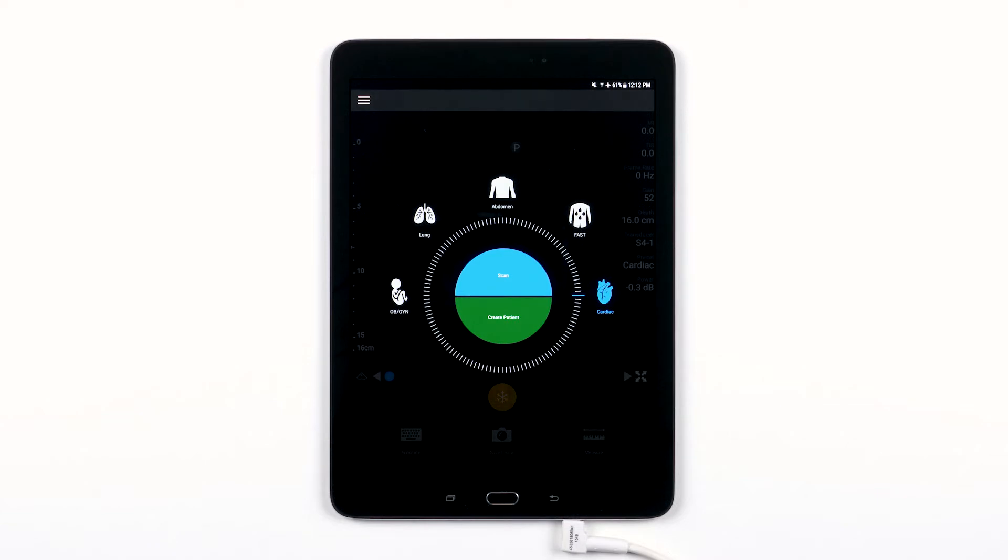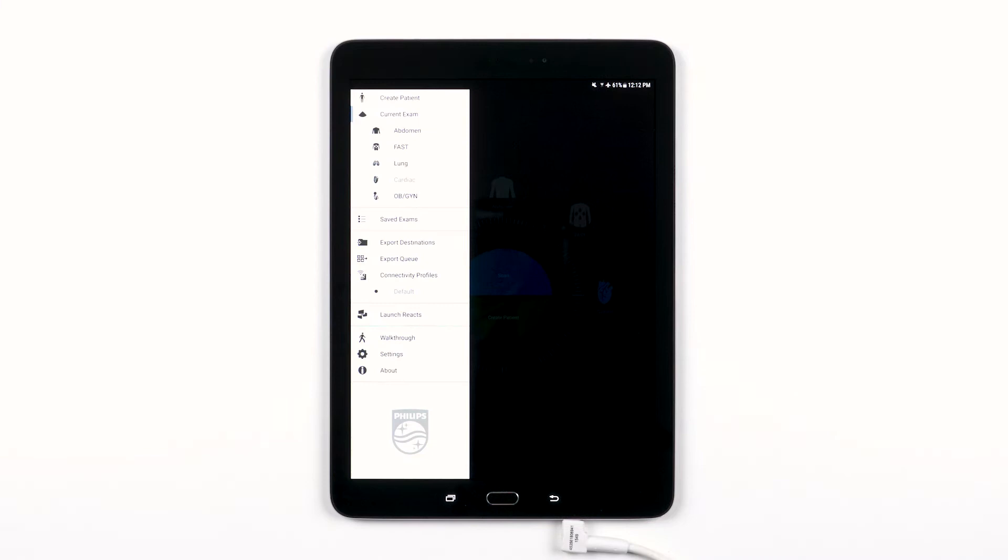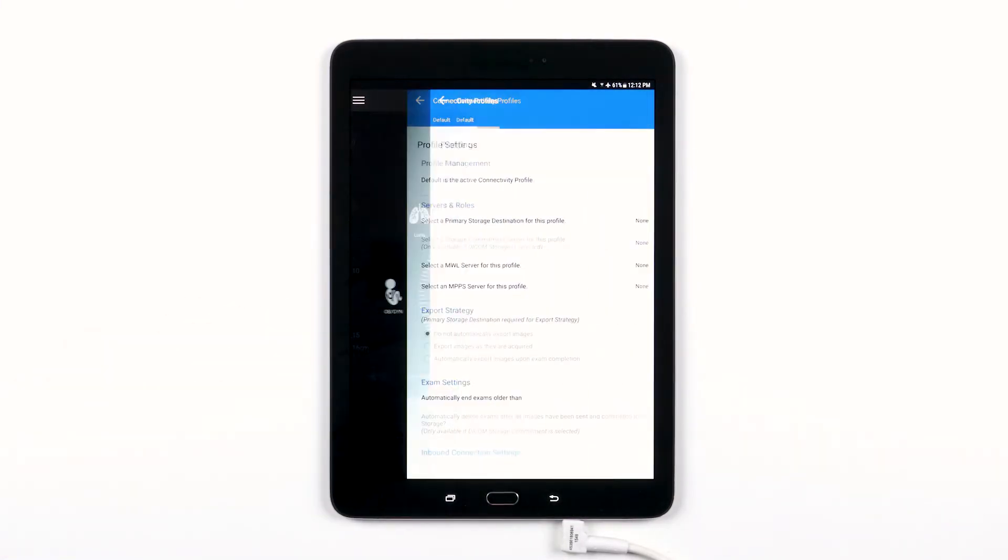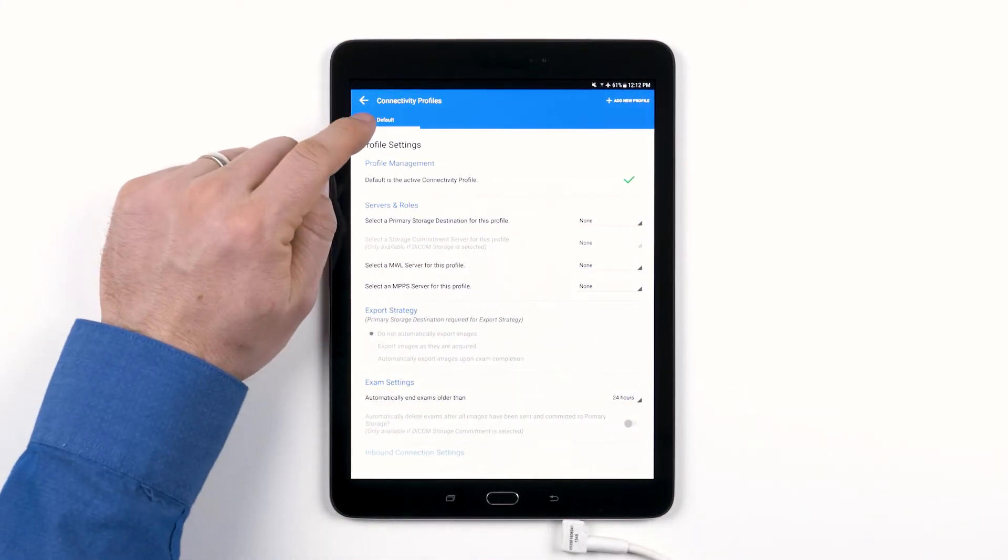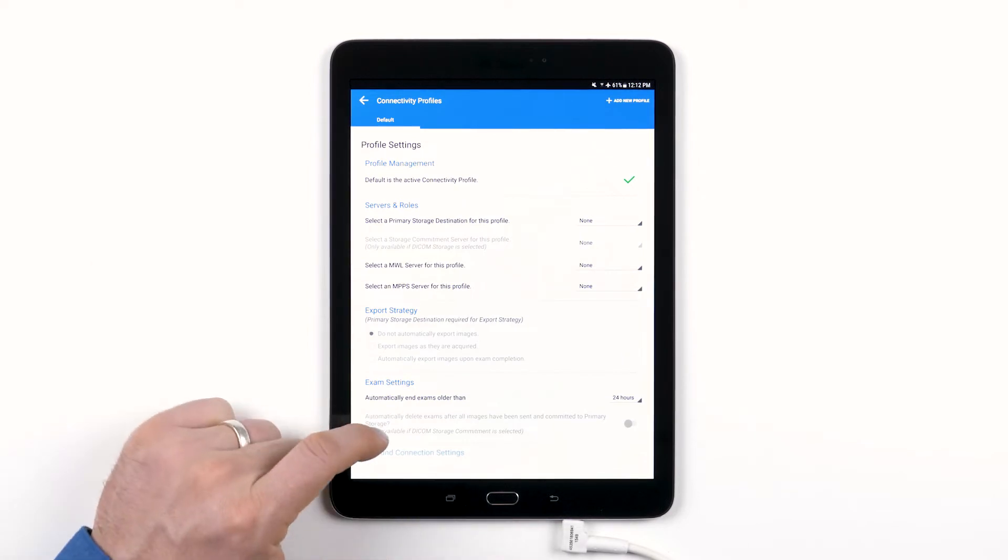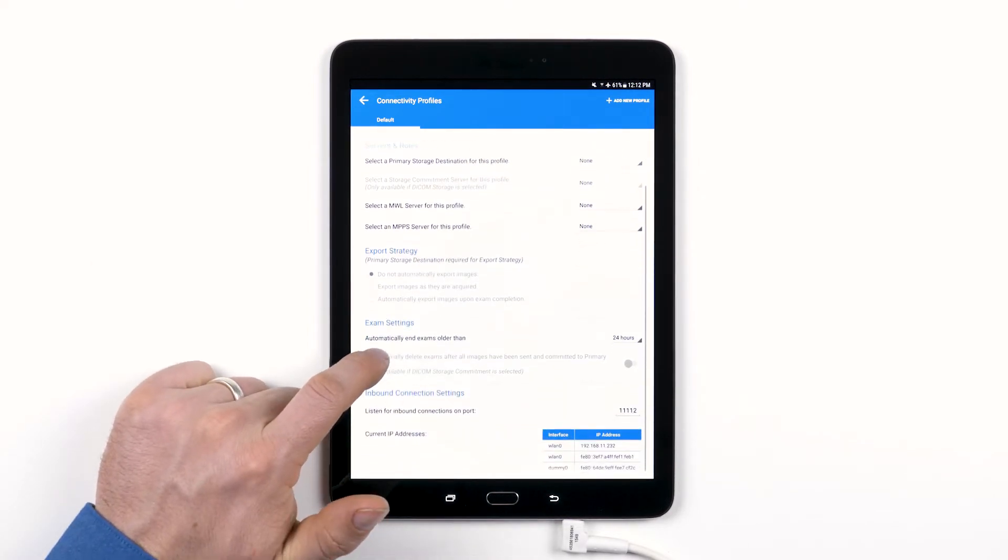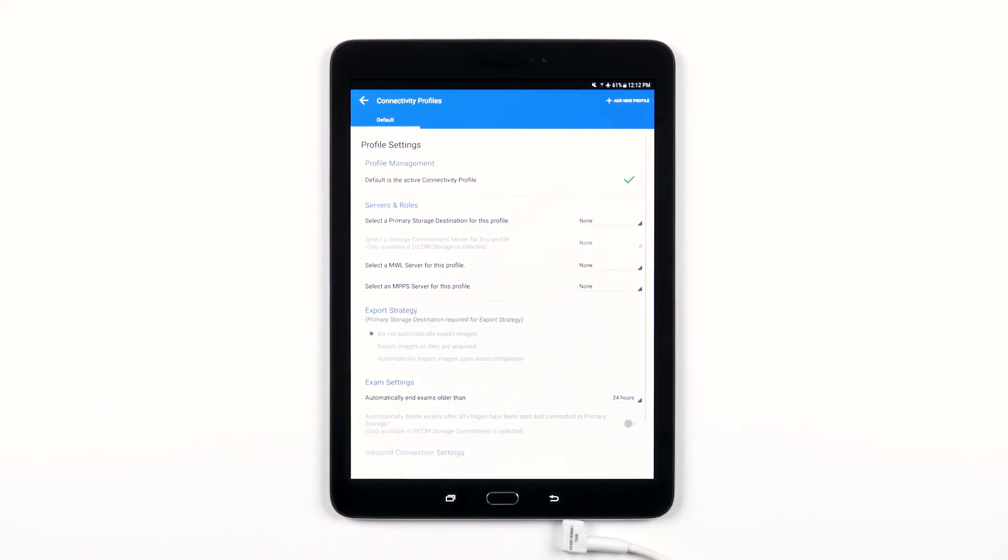To access your connectivity profiles, open your Lumify menu and tap Connectivity Profiles. Initially, what you'll see is the default connectivity profile that comes pre-populated in your Lumify app. You can add a new profile or adjust the settings within the default connectivity profile.